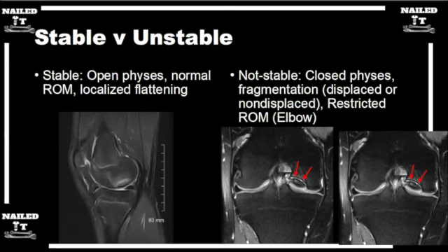If it's a fragmented lesion, which sometimes you can see on x-ray, but more frequently you can see better on MRI, then you start to worry that it could be more unstable. And then certainly in some cases, you can actually see a lesion become an actual flap or become loose or free floating, which is straightforward then, of course.